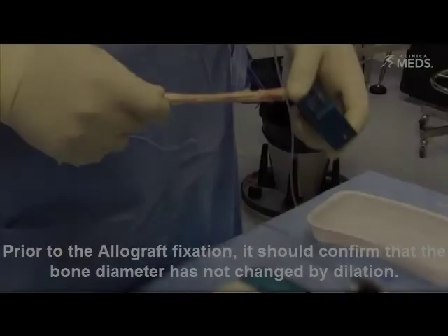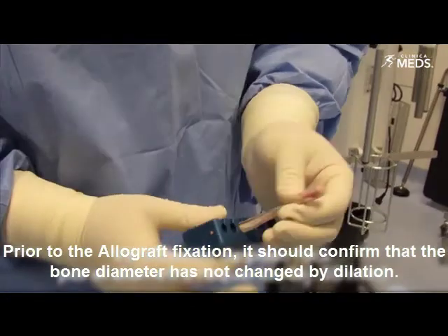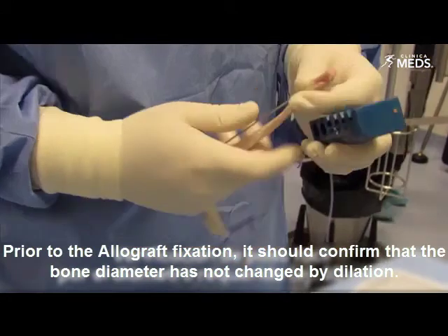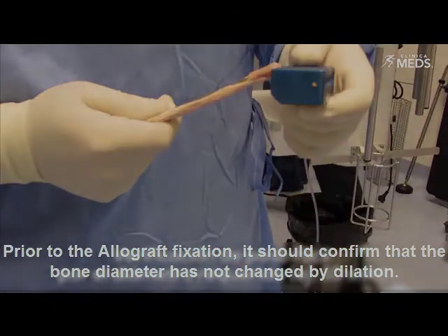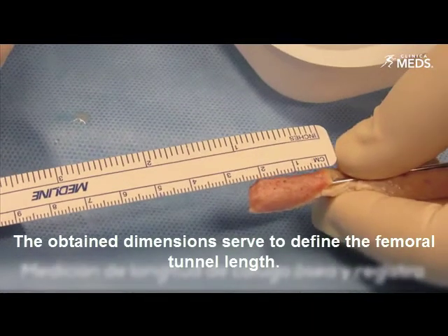Prior to the allograft fixation, it should be confirmed that the bone diameter has not changed by dilation. The obtained dimensions are used to define the femoral tunnel length.